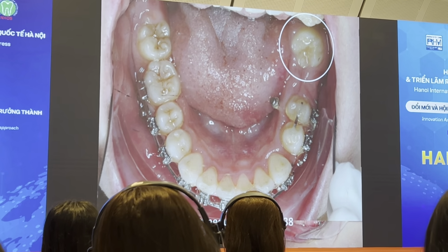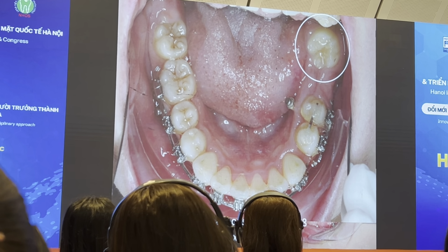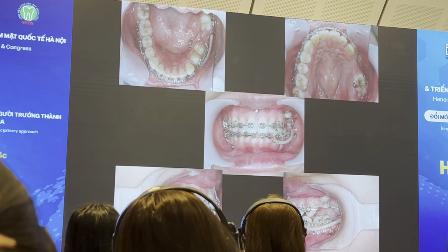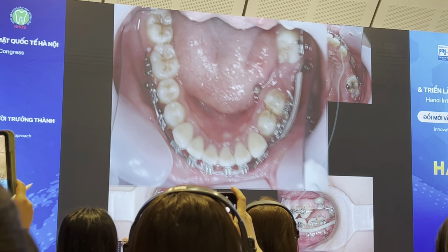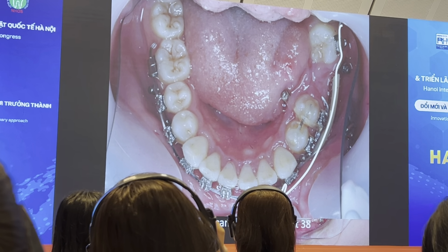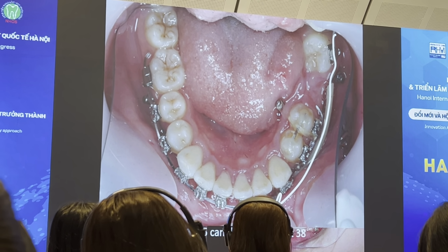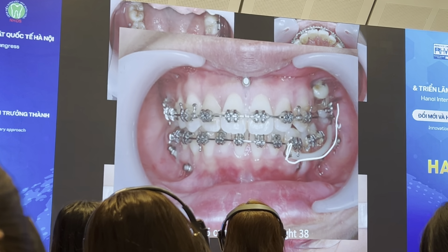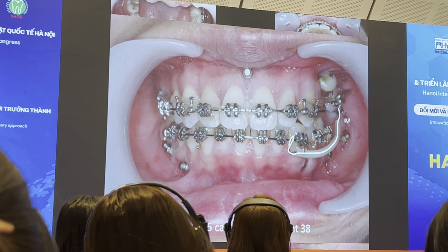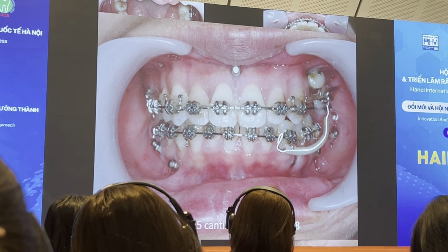And on the lower occlusal view, we can see that 3.8 erupted spontaneously after the extraction of 3.7. This was the time when I bonded 3.8 and inserted a beta titanium 17x25 cantilever to upright the tooth. We can see the cantilever from the frontal view, which was covered by a plastic tube to protect the cheek mucosa.